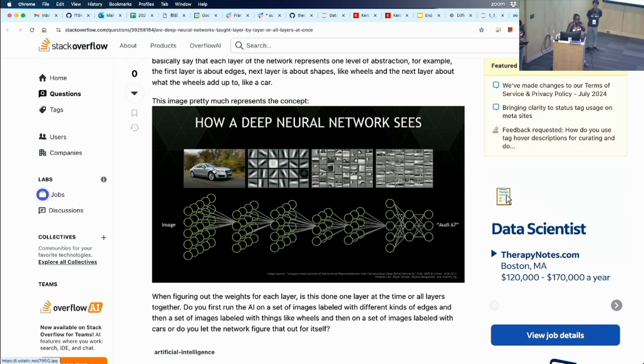So all these concepts should be starting to, I just want you to make a mental model so that you can go back and either say, okay, I understand this, I'm going to be a data set person, or okay, I usually code in non-imaging data, but I understand the basic components. So now that means this weekend I can do more on imaging data because I'm getting the framework for doing this. Or I will be like Judy and Harry or Pochi, who's supervising students, and I just need to be able to understand what they're doing, right? There's so many directions everyone in this room can go.